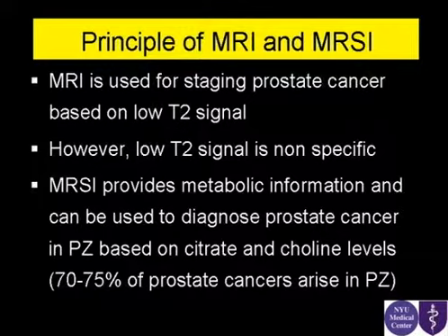So usually what I do when I read a prostate case, I don't read the images, I read the whole case. So I always get the biopsy results, the PSA, the history of the patient. Did he get any treatment? Did he get any hormone therapy? So that's extremely important to read a case.